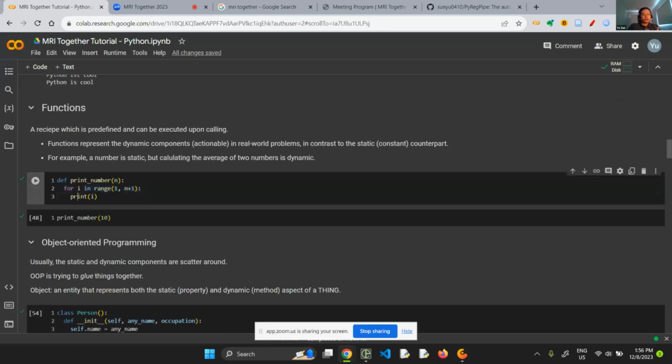Again, here I use def to define a function, and that's the keyword in Python to define a function. Then inside the function body, that's whatever recipe goes under that. You will notice that there are some indentation differences, which is quite important in Python. It's not very important in C because they use curly braces anyway, so you can tell what the indent is. But in Python, these are important. This will tell you what the hierarchy in this code is.